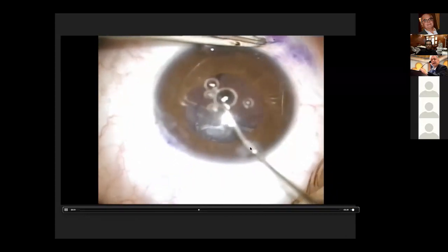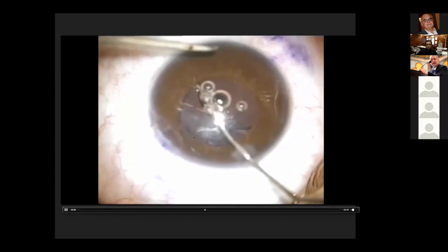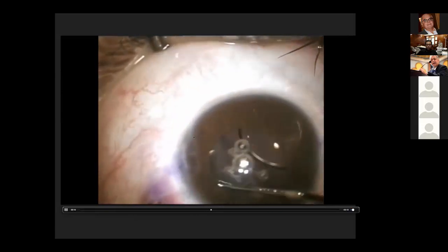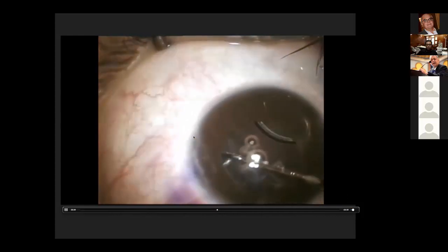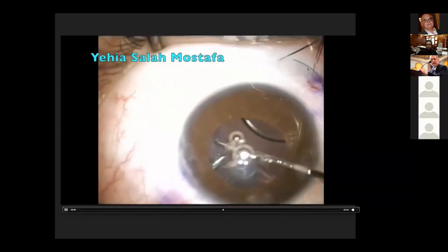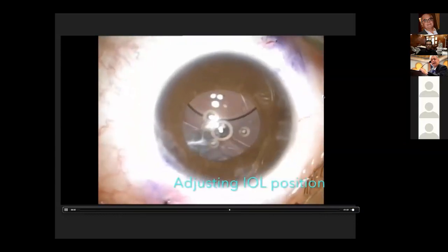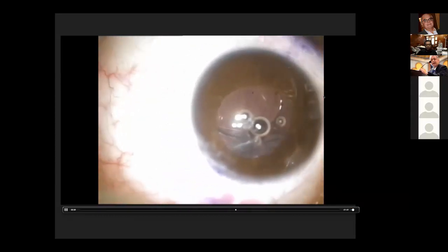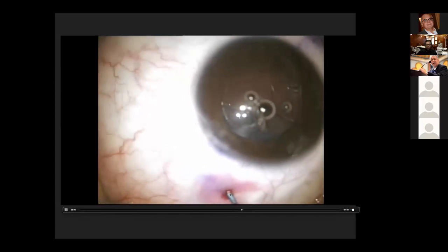The second haptic, now I'm dealing with the second haptic. It's obvious for me now that I cannot keep this capsule. So I'm going to repeat the maneuver for the second haptic. Feed it into the bore of the needle. Look, the haptic here is out, the first haptic, with a good length. And then with both hands, you start centering the lens and you deliver the haptic here outside of the sclera and conjunctiva.